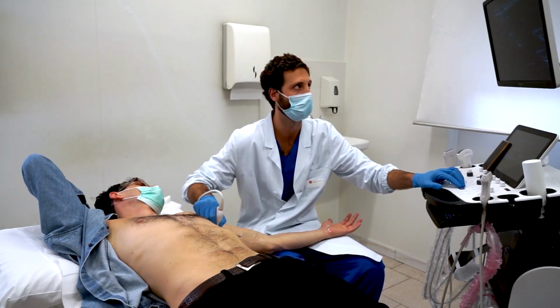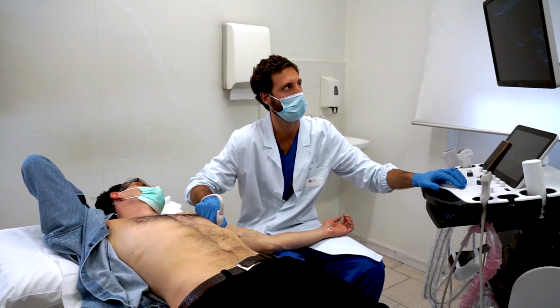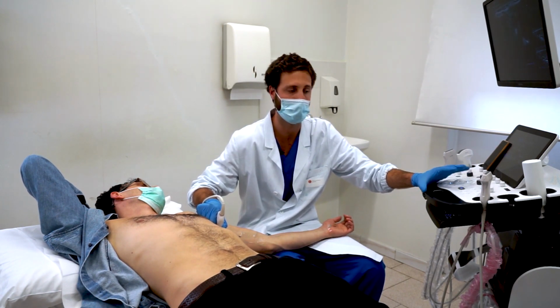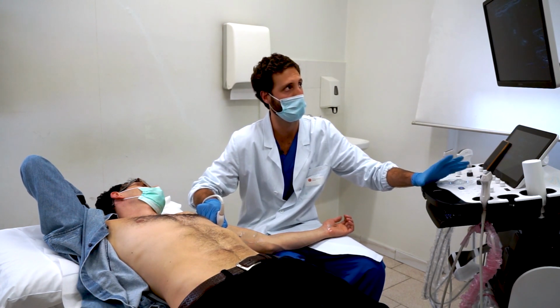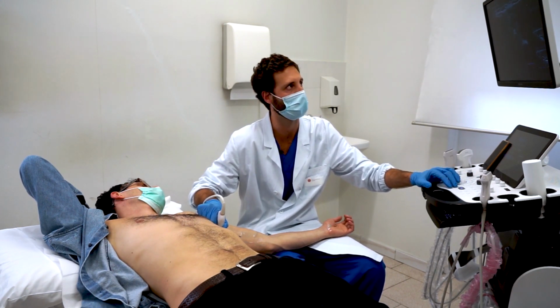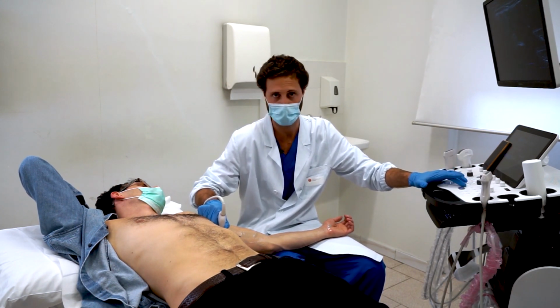Before starting our ultrasound evaluation of the median nerve, we should make some considerations. To do this scan, we need high frequency linear transducers with frequencies ranging from 12 to 18 megahertz. Then we have to adapt our probe and the settings of our machine to the part of the nerve that we are evaluating, because the nerves of the upper limb, and of course the median nerve, can be deeper or more superficial, as well as its branches.